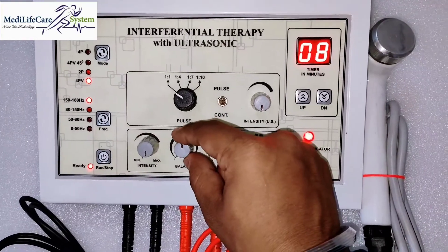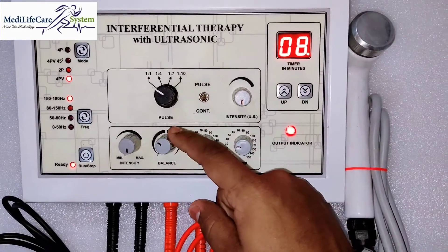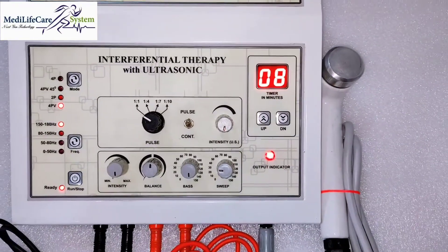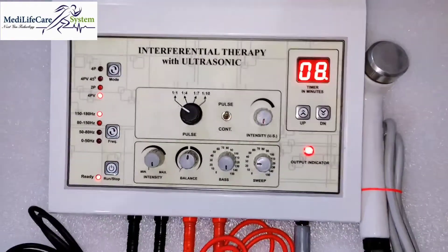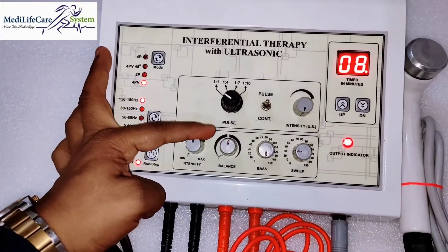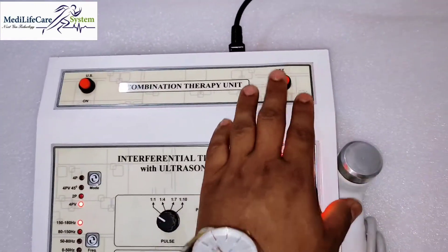This is the balance for the right side, which you can adjust here, and for the left side you can shift here for balancing. You have to set the 90-degree angle for both outputs. From here you can balance and maintain your intensity. If you want to stop IFT, simply press this button.